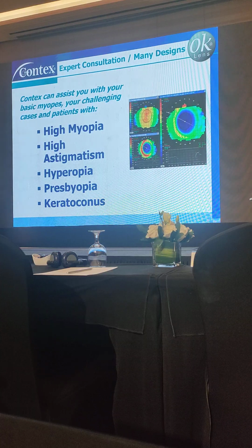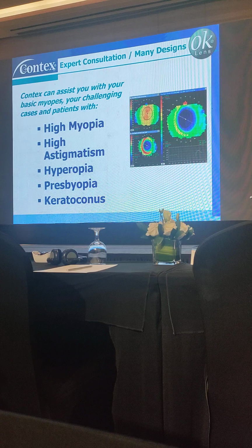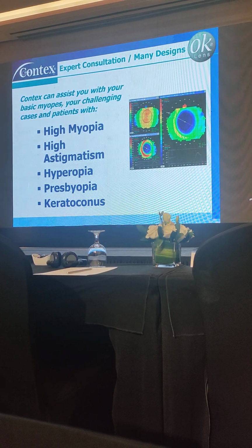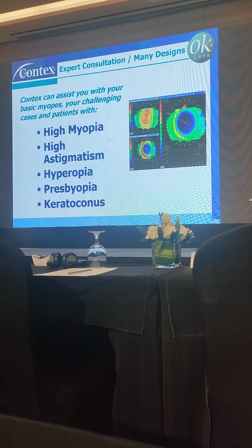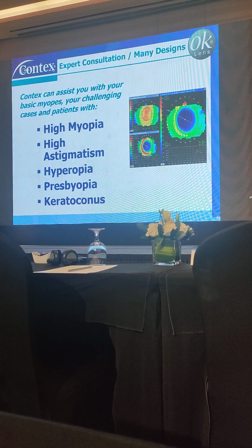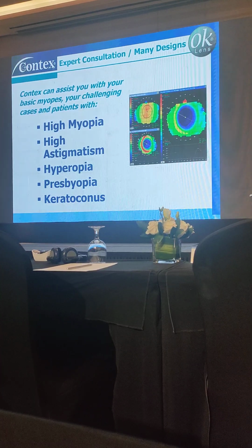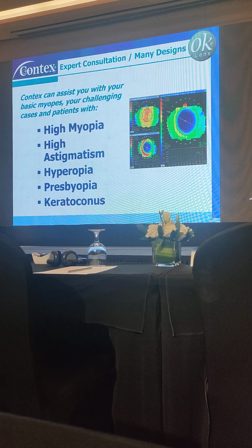And that's more examples, not specific cases, right? They're specific, but I'm not going through every number and detail, but going through the general theory on toric lenses, and so when do you need that toric lens? We've said 20, 30 to 40 microns. And then you as a doctor, it's up to you. When you put a spherical lens on and you see that tilting, then you know you need a toric right there.